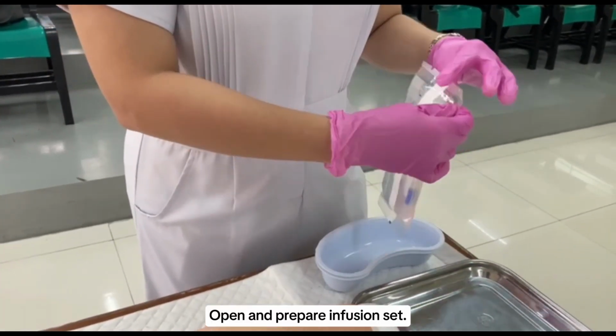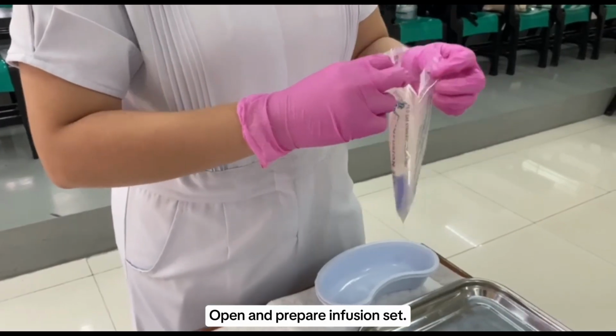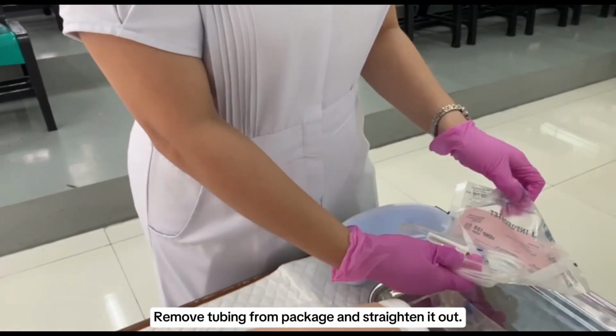Open and prepare infusion set. Remove the tubing from the package and straighten it out.